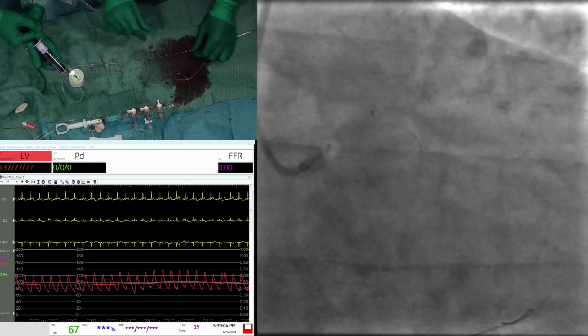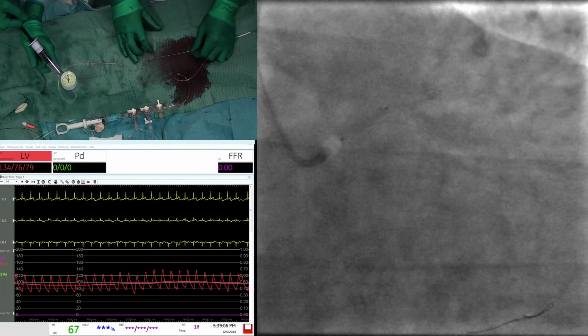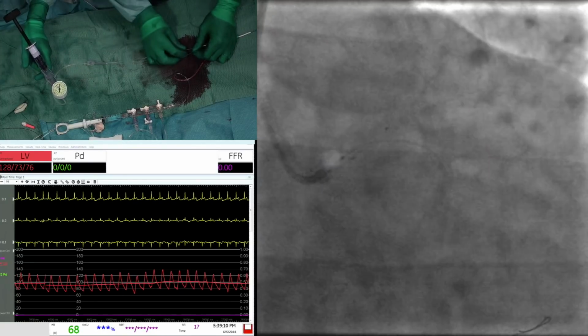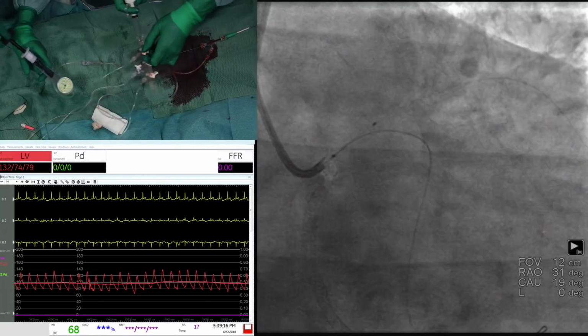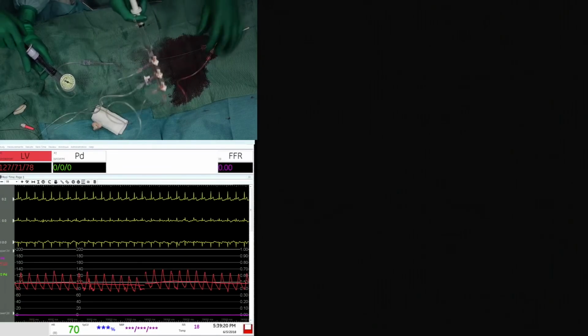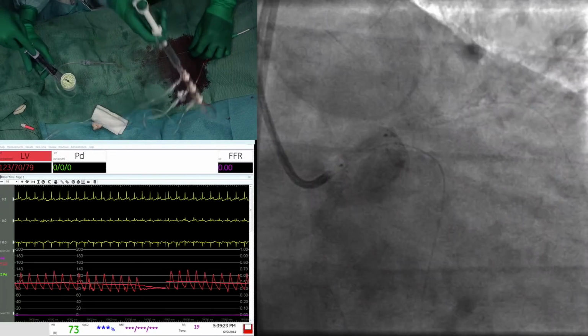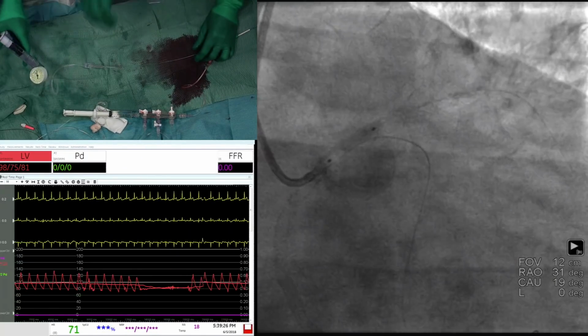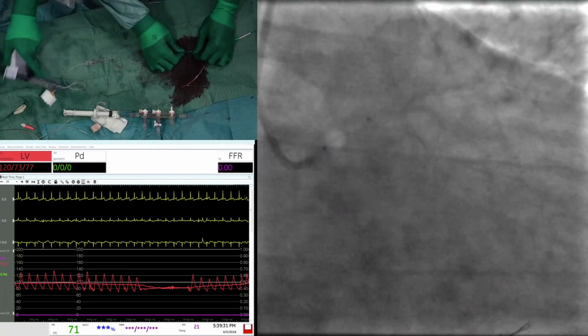Eddie, could you come to the patient just to tell them? I didn't feel that, it's fine. It's not a problem. Okay, we're going to also dilate the ostium. Yes, I will film it with a bit of contrast. 14. Look, this is only a 3 millimeter, and it looks like a 3.5, because all the vessels are so small.